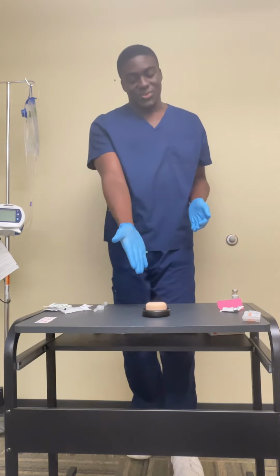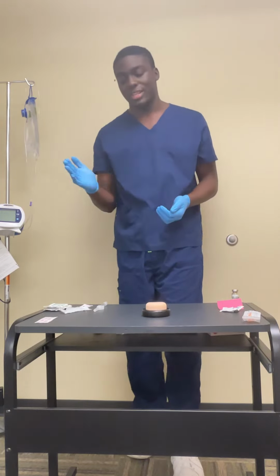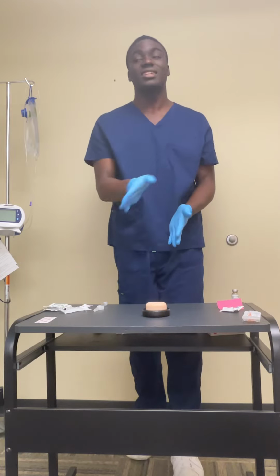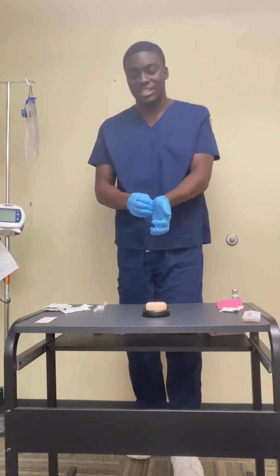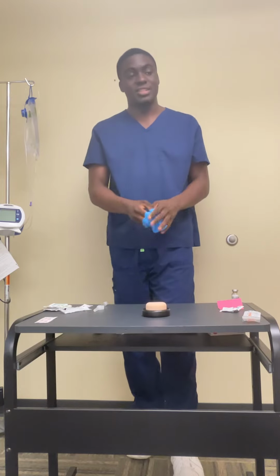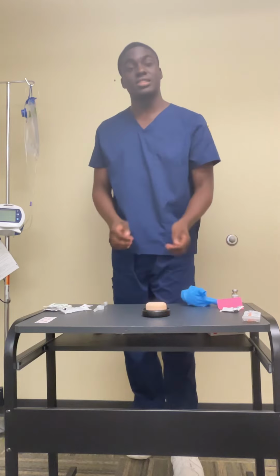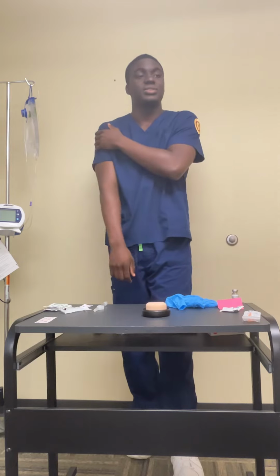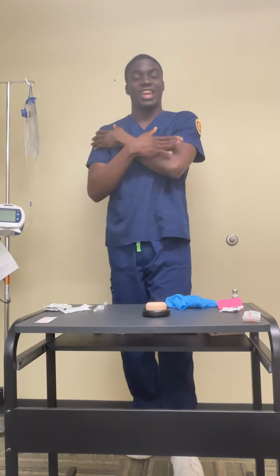And then I will assess the need for a Band-Aid or a patted dry, and then I will check my 5 rights again, ensuring that I gave the right medication. Then I'll ask my patient, I will assess the site for any adverse reactions and monitor for 15 minutes for any adverse reactions. And then I will clean up my area, go to the patient's MAR and document the injection, how much, the patient's name, date of birth, time of the injection, route of the injection, which would be the right deltoid, and the reaction to the administration. And I am done with the intramuscular injection using the Z-Track method.